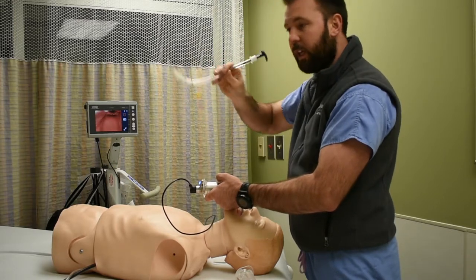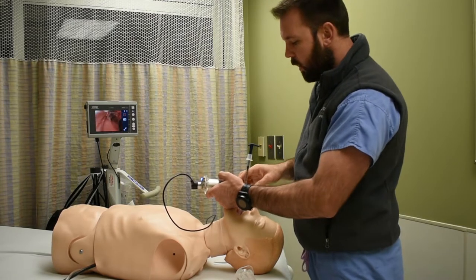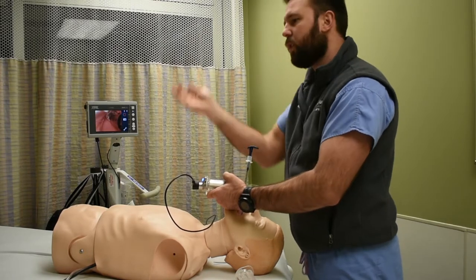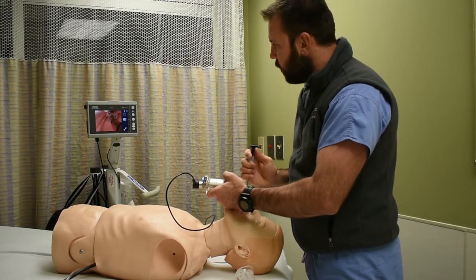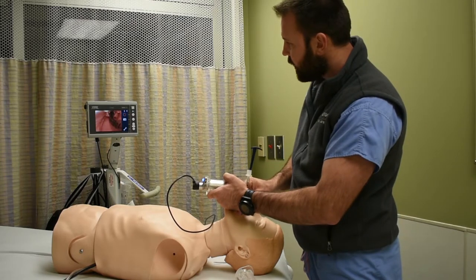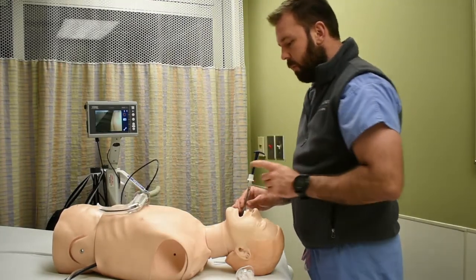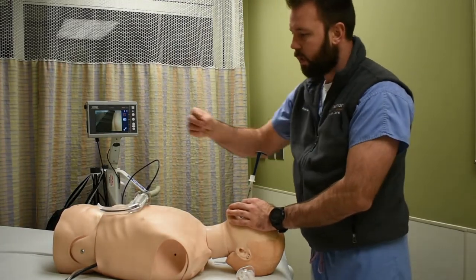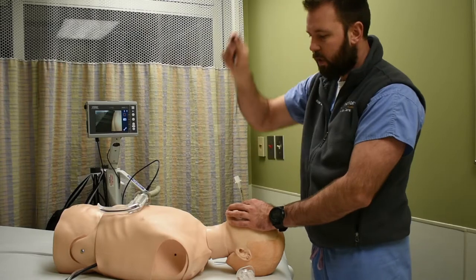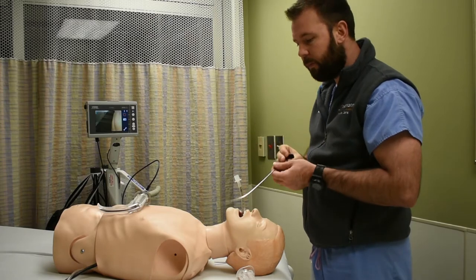You need to inch back away from the vocal cords to allow the hyperangulation of the stylet to do its job and curve up past the tip of the D-blade. Once you get into the vocal cord area, the hyperangulation can cause you to hit the top of the airway, so once you're through, you may have to use your thumb to back the stylet out slightly and then advance the tube further. When removing the blade — and especially the stylet — pull it down toward the patient's feet so the curve of the hyperangulation doesn't come straight out, which could damage the tube or pull it out from the vocal cords.